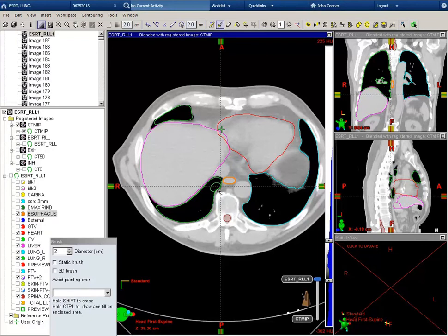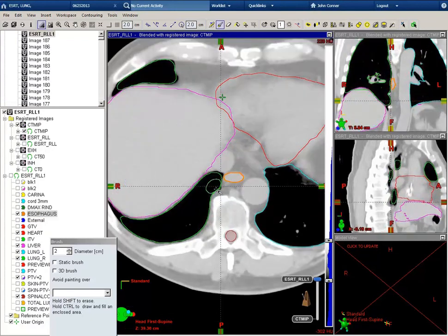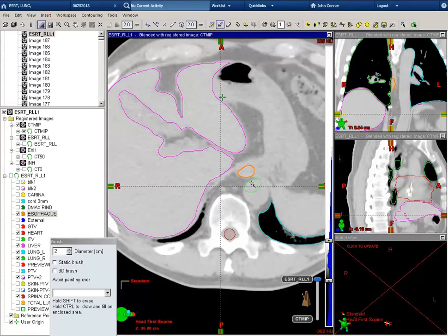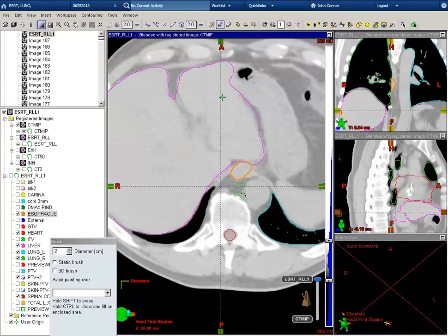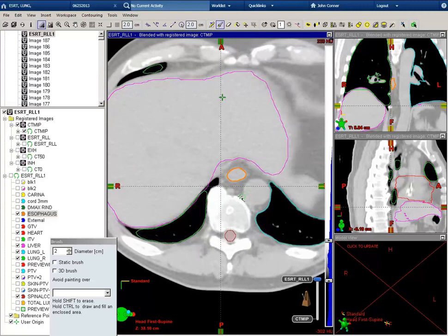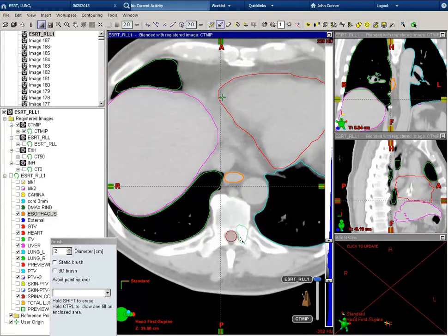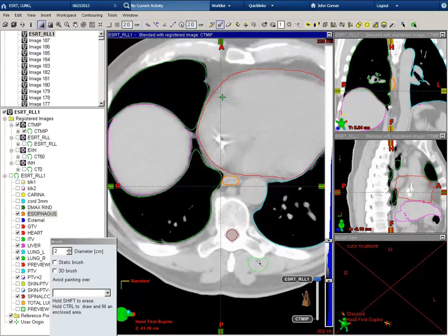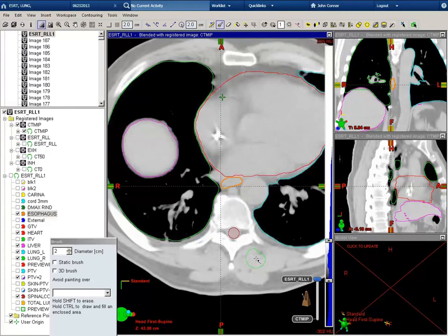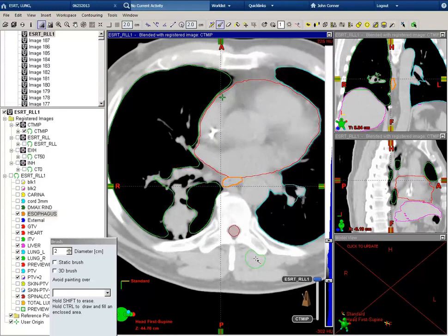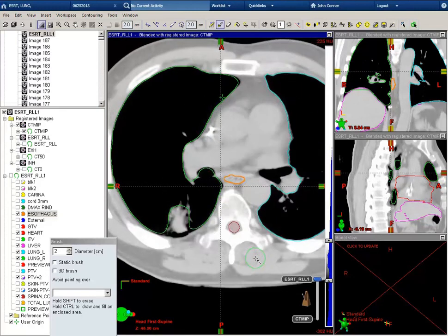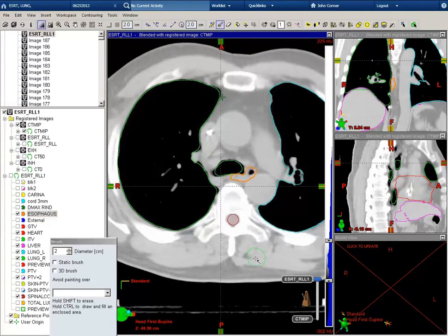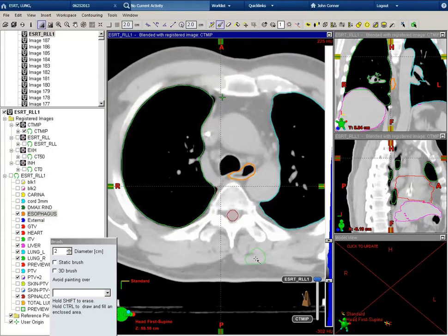Next, let's look at the esophagus. The esophagus is here in orange. Let's look at the most inferior extent of the esophagus — it's where the esophagus enters the stomach. Then we'll track this contour superiorly, making sure that we don't overlap the esophagus with the heart. The esophagus is a very long structure with a lot of slices, so this would be a good structure to use the interpolate button on as well. Remember to double check every slice.